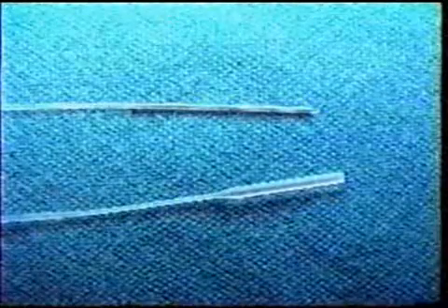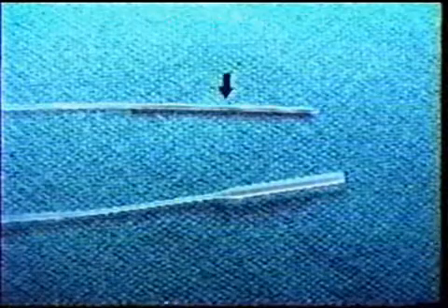This is a close-up of the very large diameter end of the stent, which is shown on the lower portion of the photograph. And on the upper portion of the photograph is a smaller diameter end of the stent with a completely enclosed short probe.